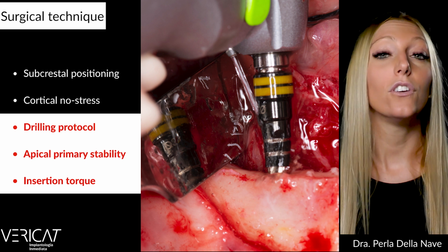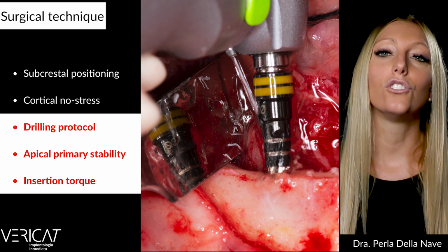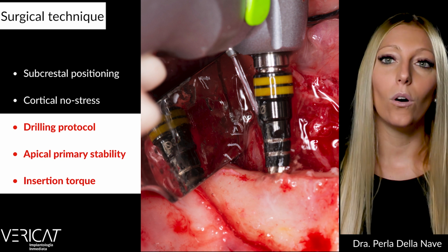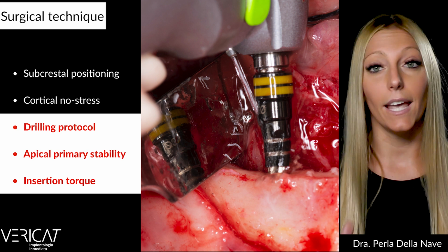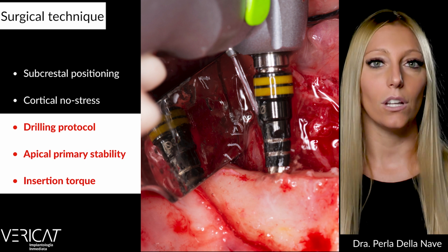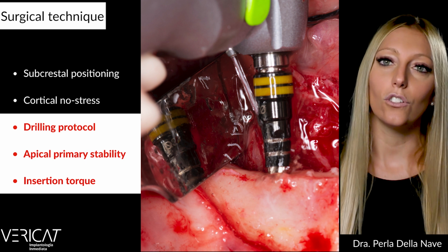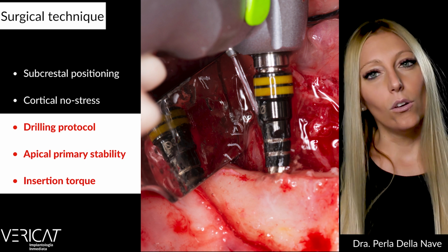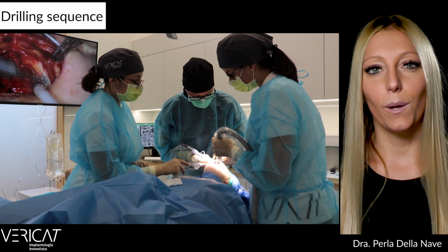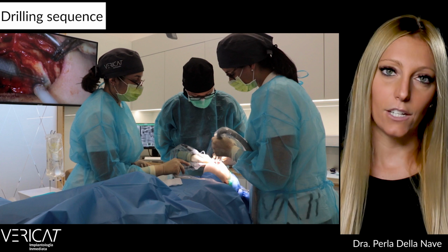And if after the first drilling the implant is not as deep as we wish, we prefer to remove the implant, drill the site more with a compact bone drill with a larger diameter or at a greater depth, or even through an over-preparation if necessary, but we prefer this option rather than using a wrench or a greater insertion torque. Let's just take a look at a short video so you can see an example of the drilling sequence during a full arch rehabilitation.